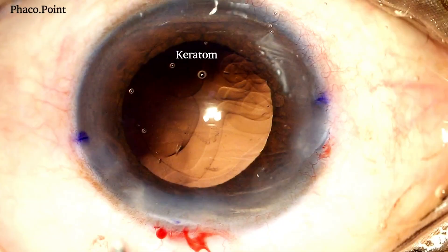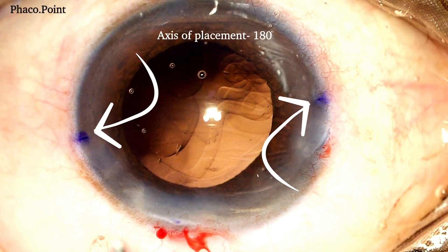Let's move to watching the surgery. This patient had a preoperative cylinder of 1.34 dioptres at 180 degrees. The axis of placement, which was 180 degrees, was marked preoperatively on a slit lamp.